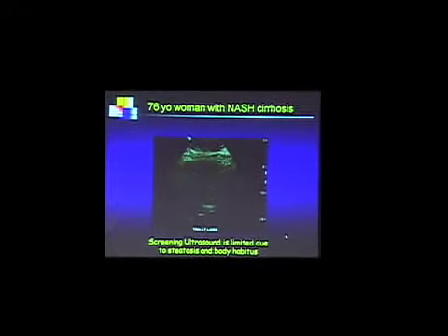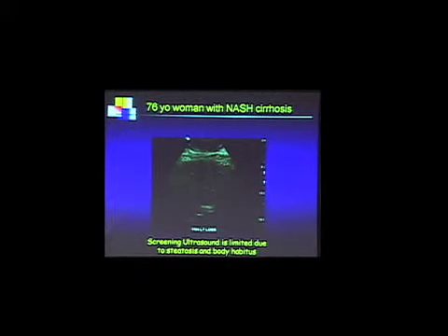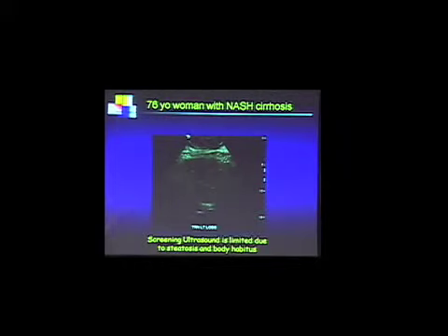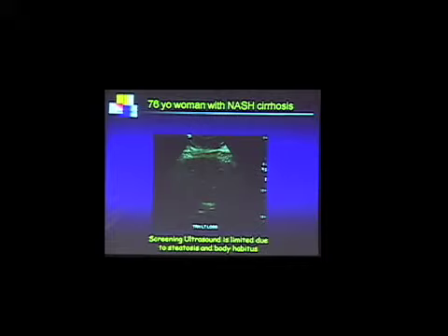This is an example discussed in Tampa recently with my friend Brad Wood from Bethesda. The other big center in the world with great interest in this kind of modality is just Bethesda. And this is, he says, a typical American patient.